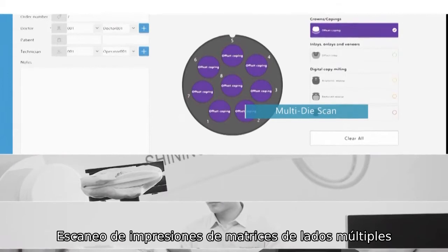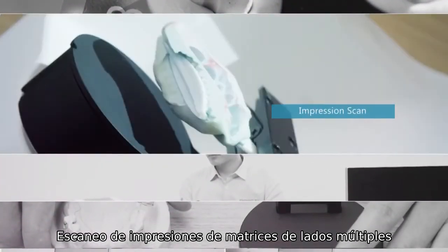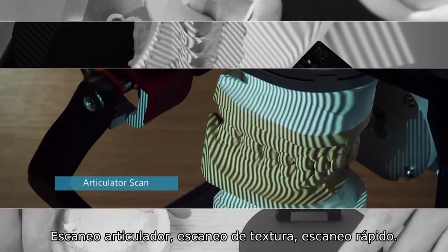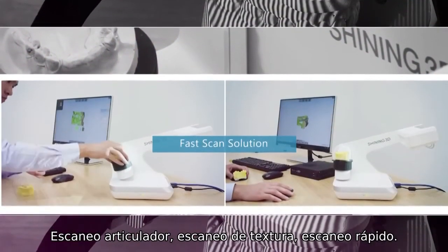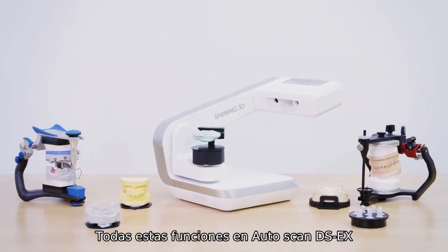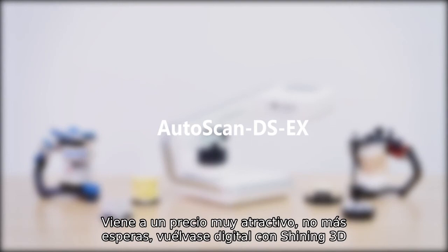Multi-die scan, impression scan, articulator scan, texture scan, fast scan — all these features in Autoscan DS-EX come at a very appealing price.